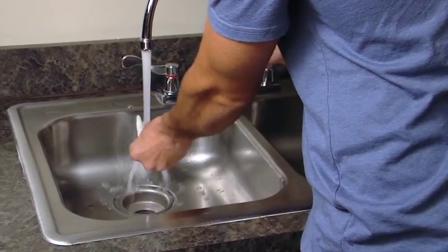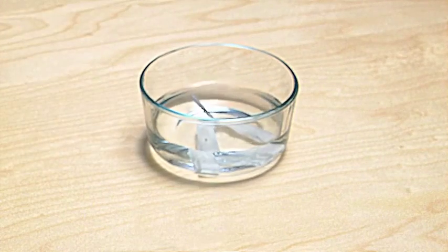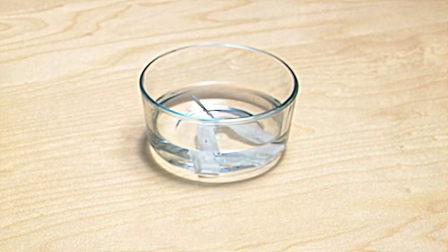To remove the upper tray, place your fingers on the top edge of the tray on both sides along the molars and pull downwards. The tray may be slightly loose, but it will continue to tighten as it cools. Run the tray under cool water or put it in a bowl of cool water to speed the cooling process.